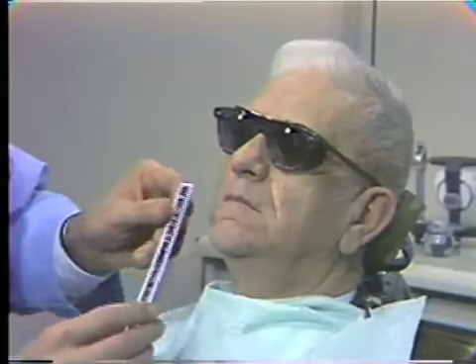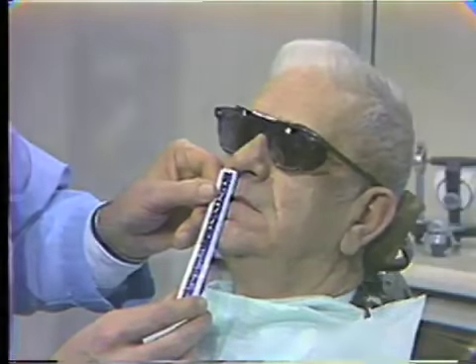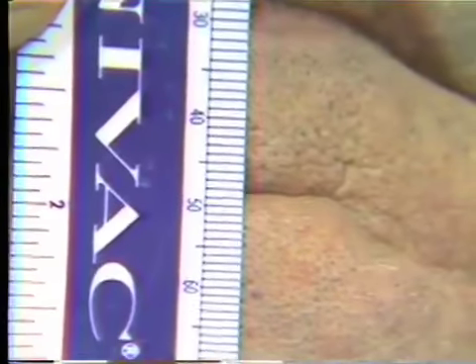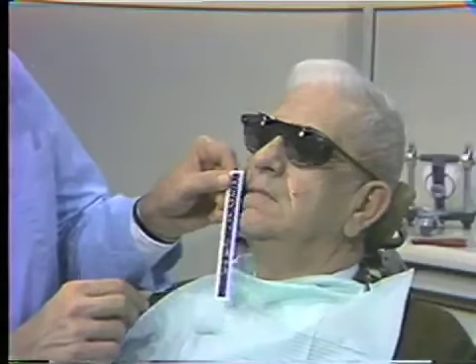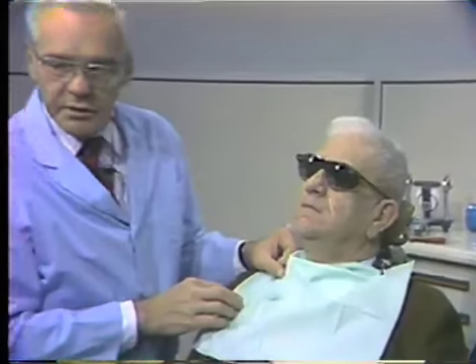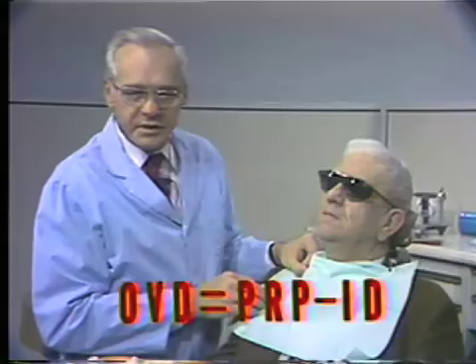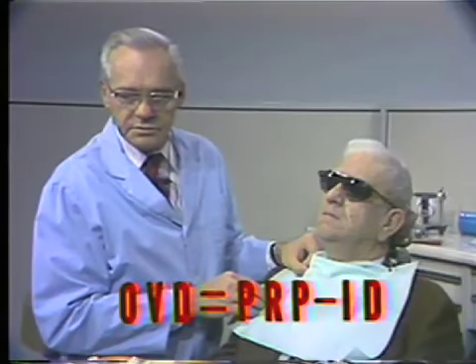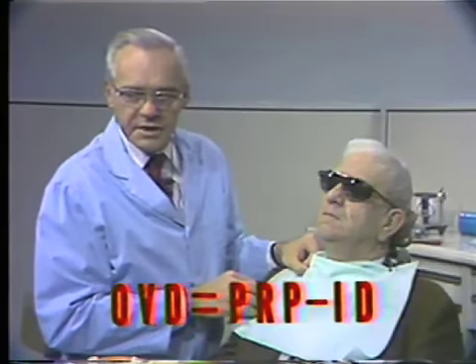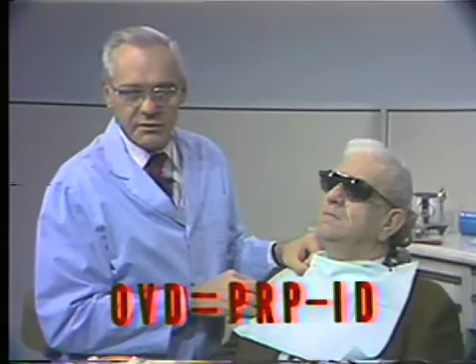So now we'll ask Mr. Monahan to open. Just let your lips close, just touch, not the wax rims. And again, we'll measure between those dots, and we have a measurement of 60. So you see, we have demonstrated again that we have a 3 millimeter interocclusal distance, or freeway space. So to summarize, we would say that the vertical dimension of occlusion equals the physiologic rest position minus the interocclusal distance, or the freeway space.